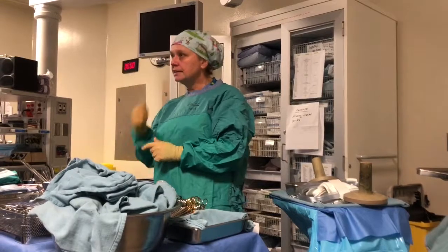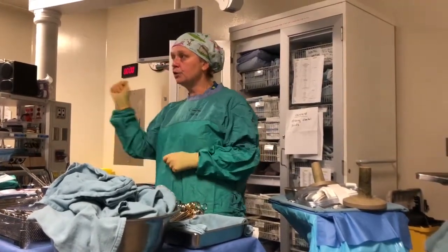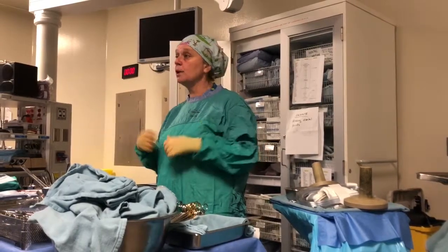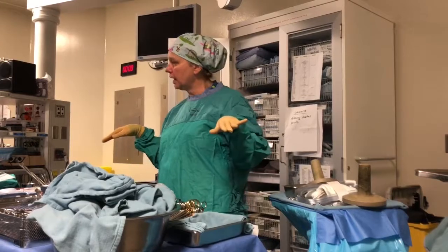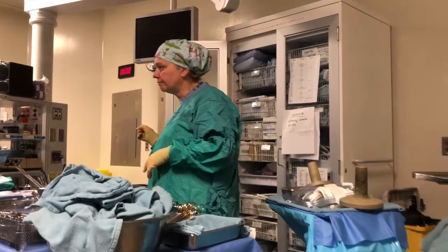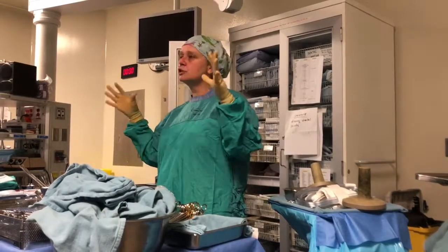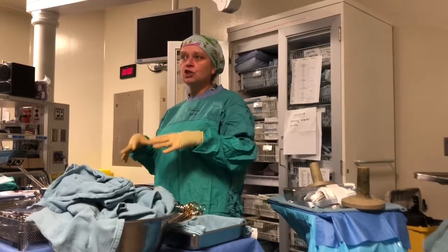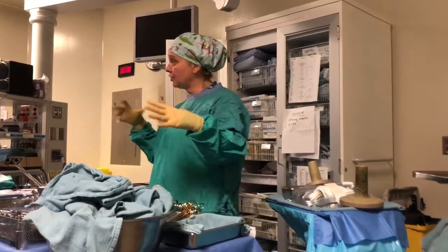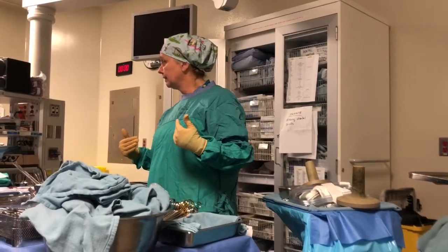So they're going to silk, they're going to cut it, and then I'm going to load up another silk. I'm going to keep on loading silks until the bleeding stops. So I usually have 3 silks on my table right from the very beginning. As soon as I use one, I call for one, right? With an aorta, right? This is just one emergency, but if you get to understand what they're trying to accomplish, you will find that you'll be able to do it, right?